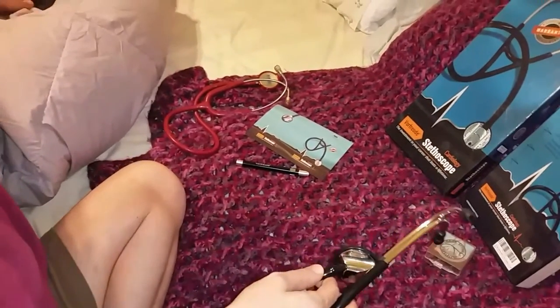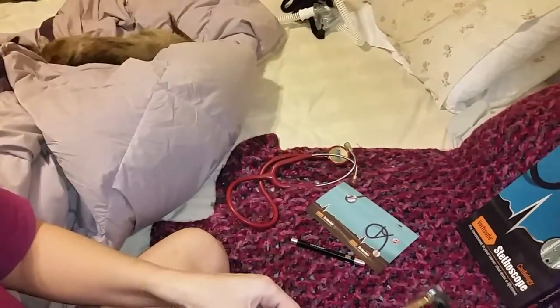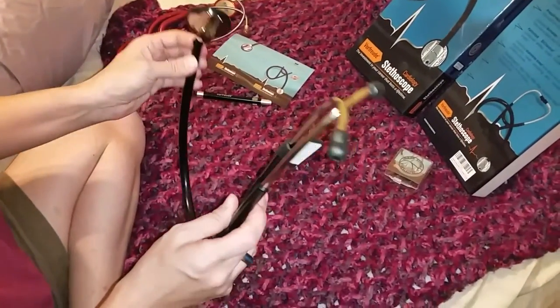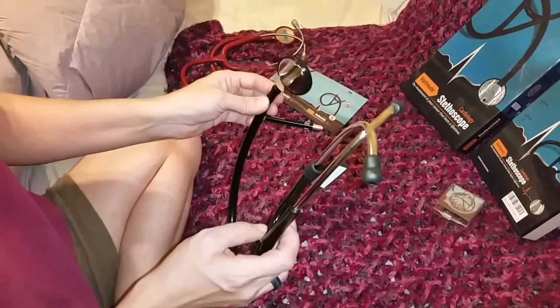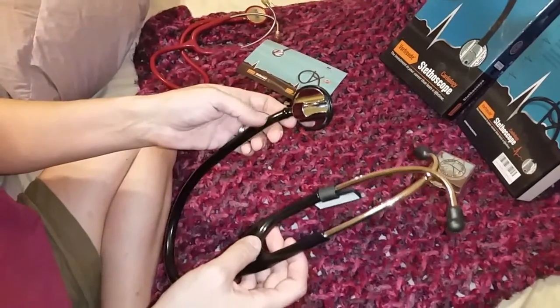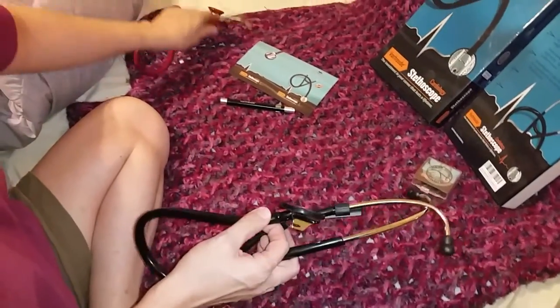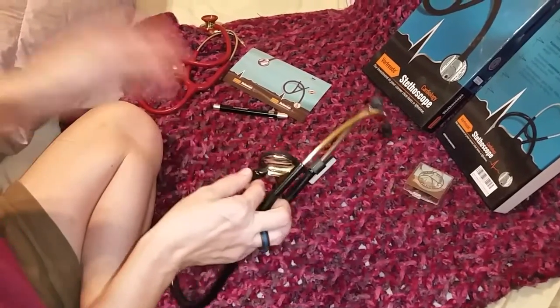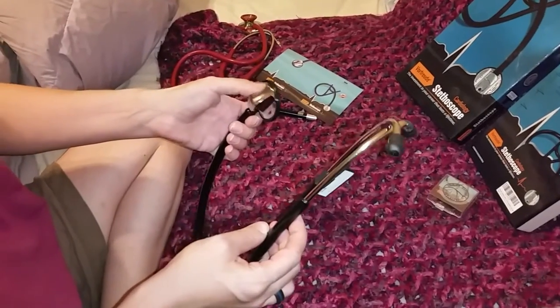My dog has a very severe murmur — he's a real old little guy. I tried on my phone to see if I could pick up the sound for you, but I couldn't. Even my husband, when he tried, could hear a huge amount of difference. He said, 'Oh, so that's what they mean by lung sounds.' So even somebody without any medical experience can tell the difference between a normal stethoscope and the cardiology stethoscope. It's a big difference, and when I used it on my dog, you can hear the difference in the quality.